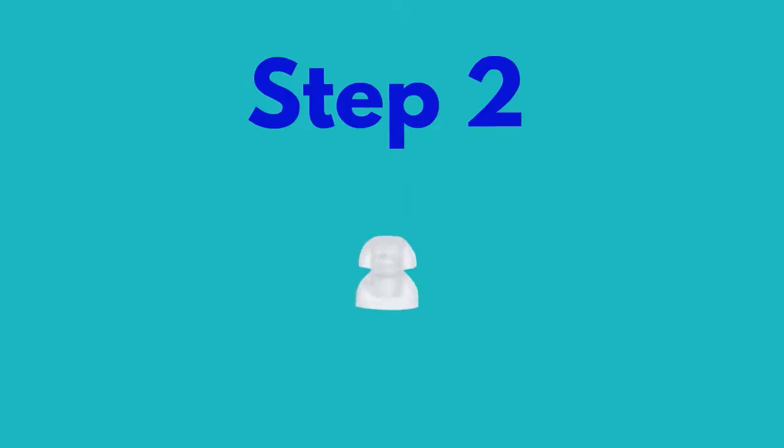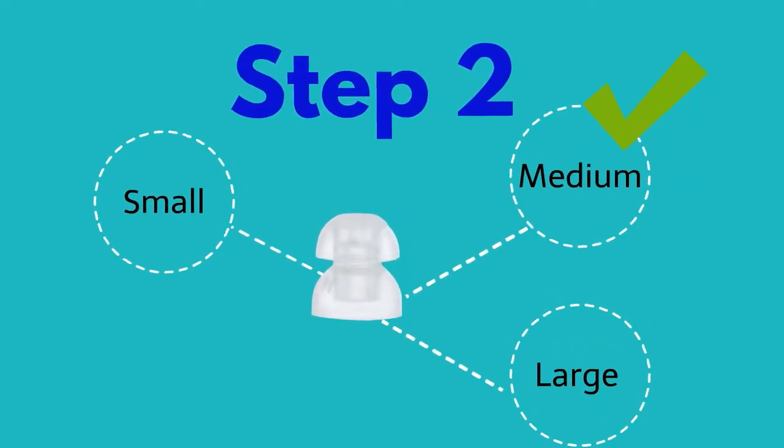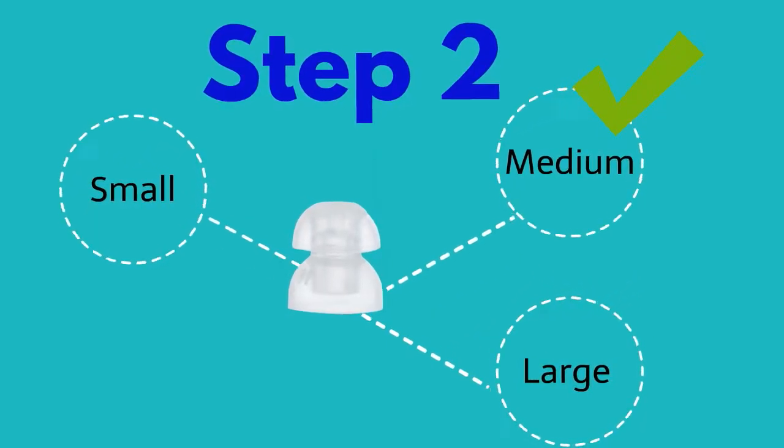Step 2: Gently pull the ear tip dome from the receiver. Your order comes with three different size ear domes: small, medium, and large. Please select the desired fit and gently place it on the receiver, pushing down gently. Ensure it is fitted securely on the receiver.